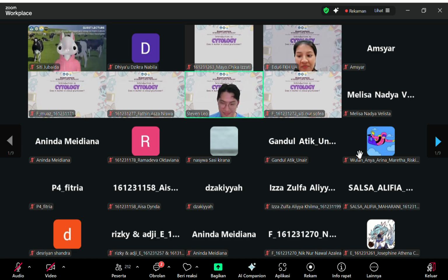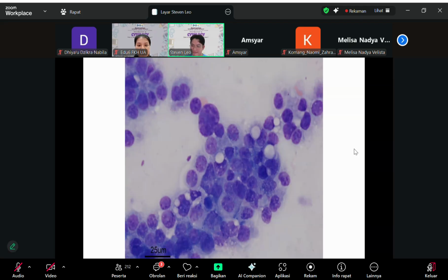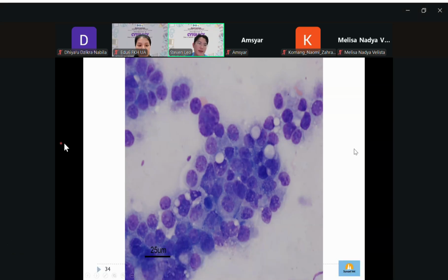Mm-hmm. It doesn't matter, it's not like an exam. Okay, good. Cancer, cancer, cancer. Yeah, that's good. So it is typically cancer. Yes, correct, because you don't see any inflammation there. What you want to see is only the cells.